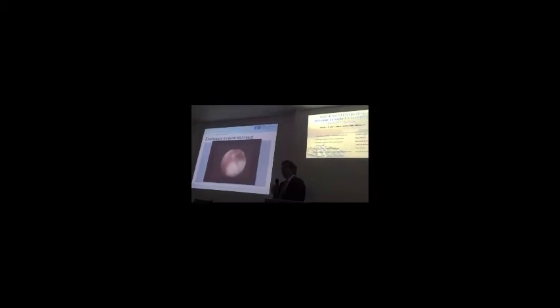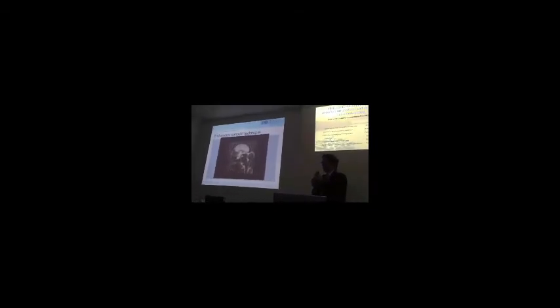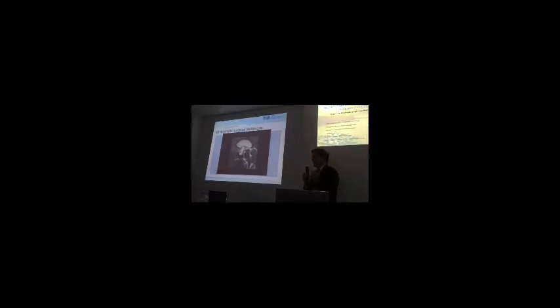It's very easy. You haven't used the Cavitron yet in any colloid cyst? I might have used it, we discussed this. Yes, in Istanbul, I was strongly in favor of Cavitron. I don't think that I have used it. It would be a nice idea, but actually the advantage of the Cavitron in this lesion is not as significant, because the content of the cyst is avascular. So to use the tube, it's very easy to suck it away. It's not a tumor in this perspective.